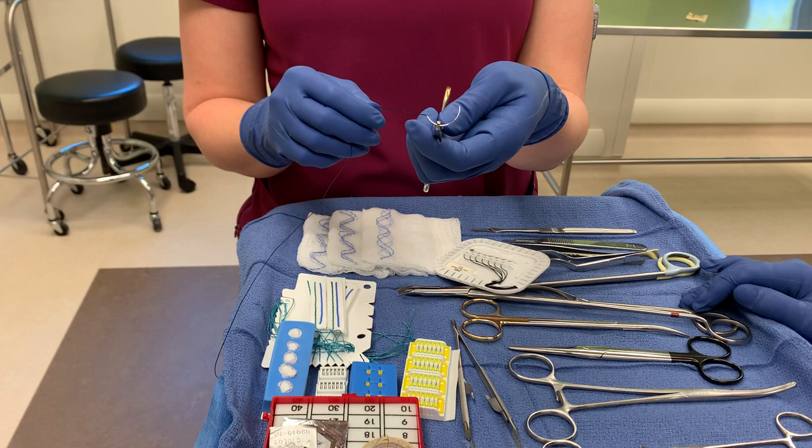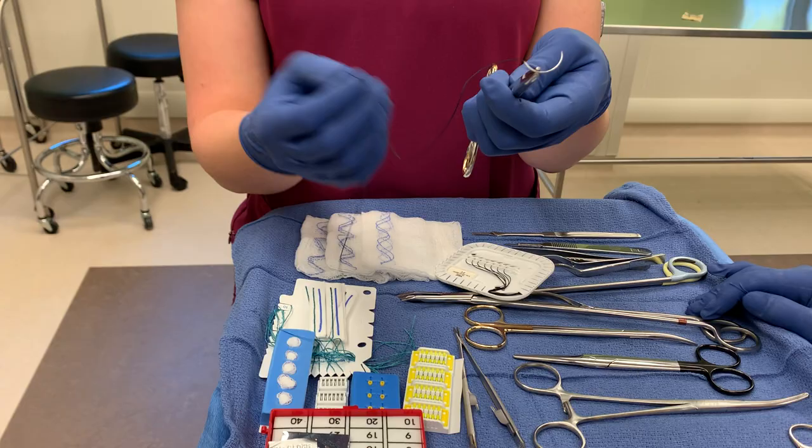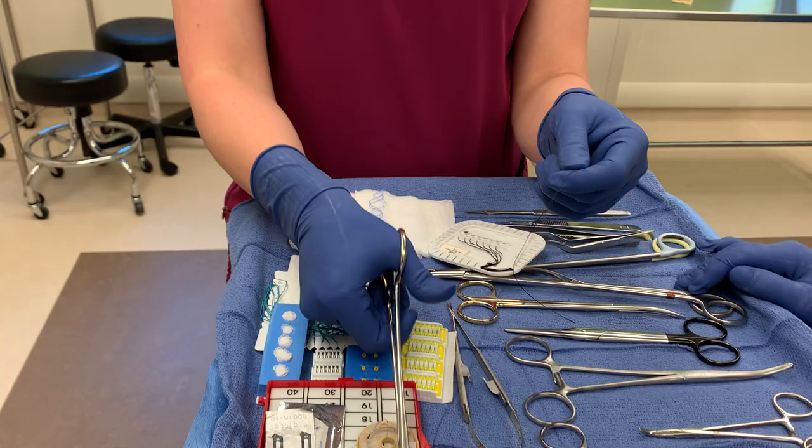The easy way to remember this: this silk tie is attached to a needle, and the needle will stick you. So if they say stick tie, they want the silk suture attached to a needle — that would be a stick tie.